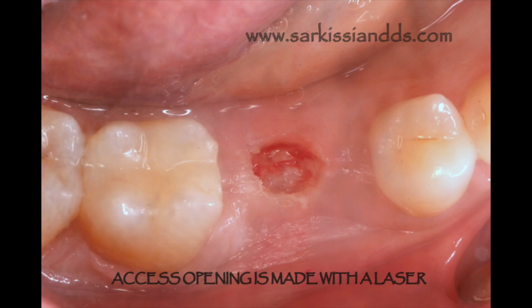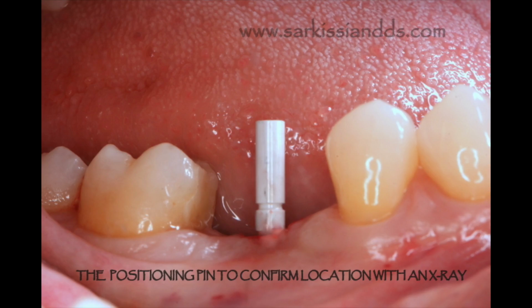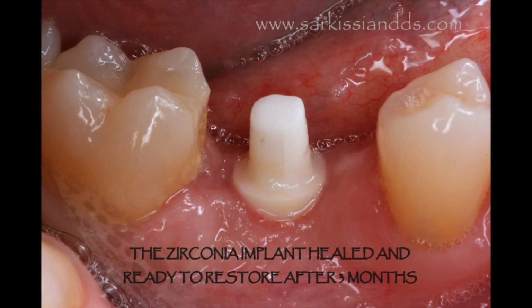After going into the bone halfway down, utilizing a zirconia drill bit, we took an X-ray with a zirconia pin in place to make sure we are in the right position and depth. The implant, in this case a one-piece system, is now inserted. All we have to do is wait 3 months.